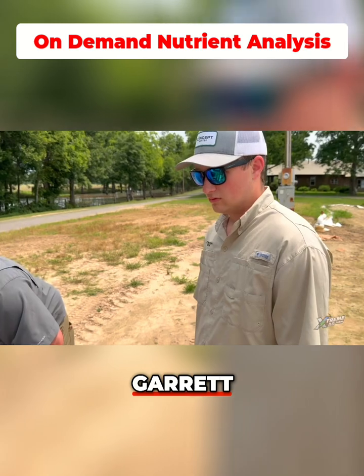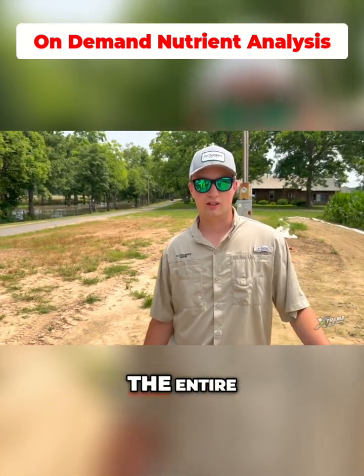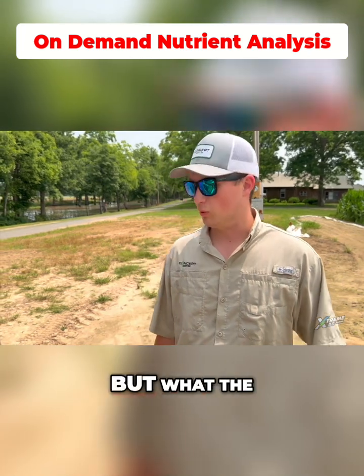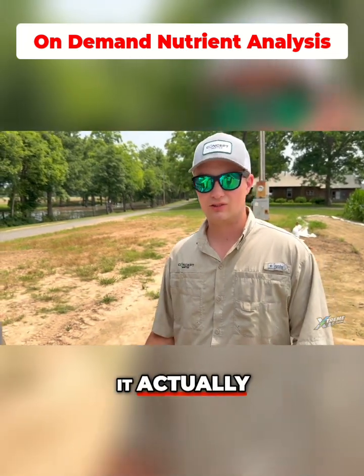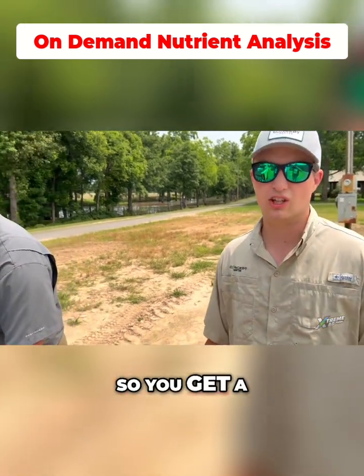So why are we taking so many leaves, Garrett? We're taking so many leaves because we want to try to get a representative area of the entire field. We walk through there and gather 10 up. The cool thing is it will actually average all 10 of those leaves together into one sample, so you can get a field average.